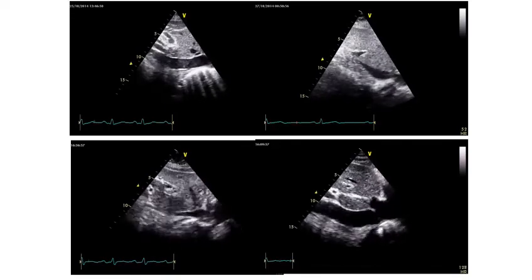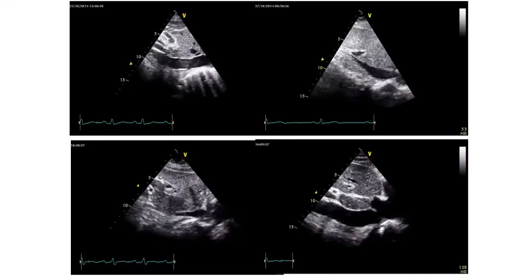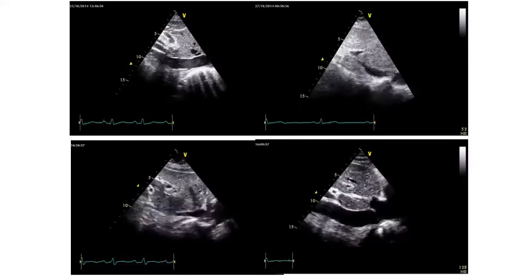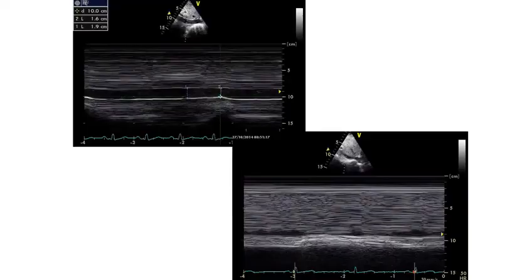So in every patient coming with a shock state, you must always interrogate the IVC to make certain that it is not hypovolemic shock. Hypovolemic shock is a situation where, if it is recognized promptly, it can be completely reversible. How to approach this in intubated patients in IVC, sir?